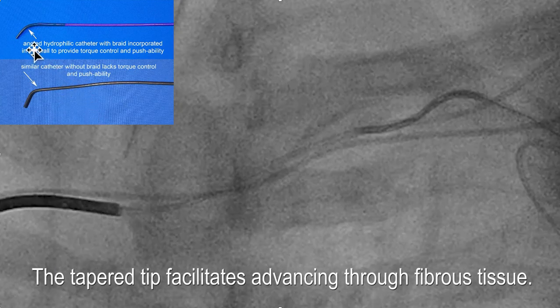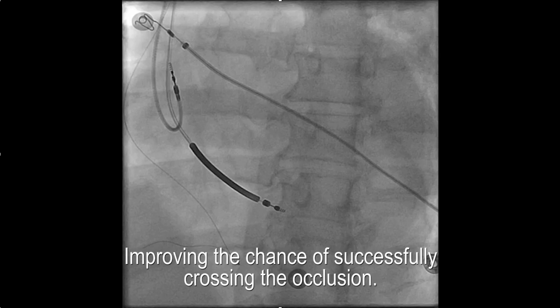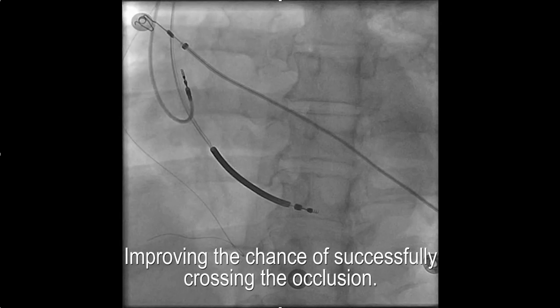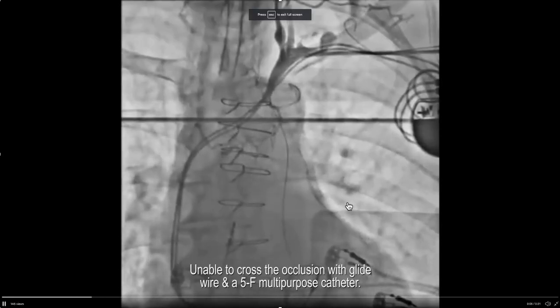Finally, the tip of this catheter is tapered. If you're trying to get the tip of the catheter into a narrow area, it's nice to have it tapered so that it will go into the fibrous tissue, improving your chance of successfully crossing the occlusion. This catheter selection is important.